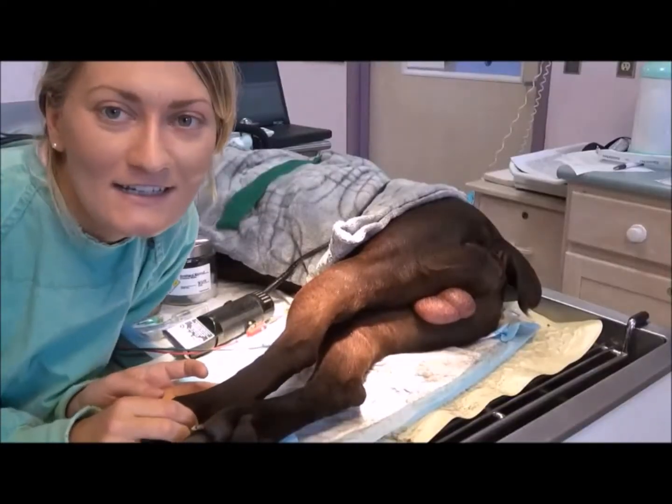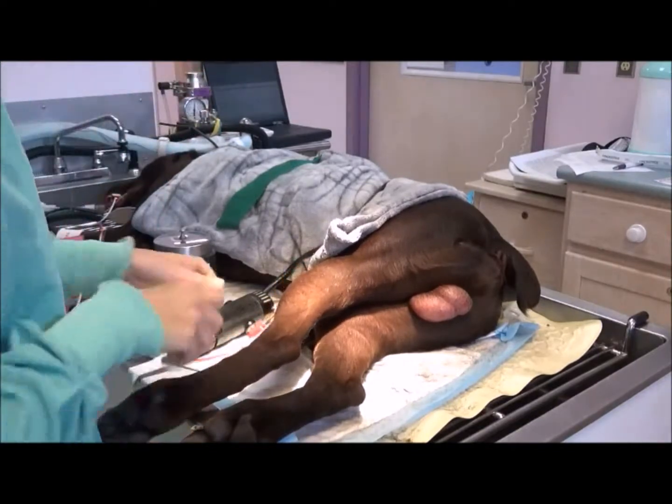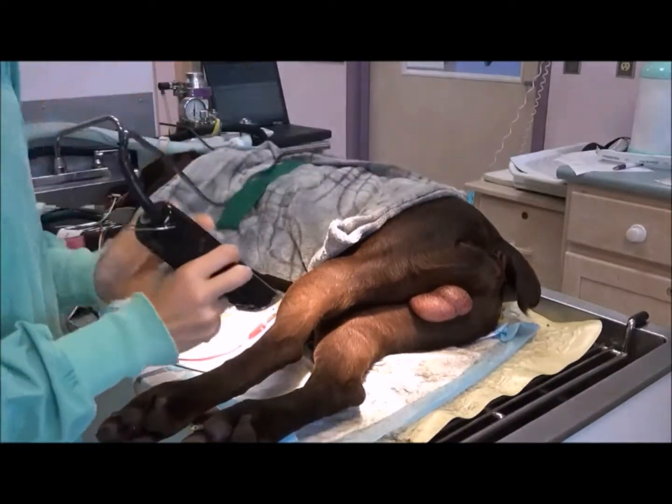I'm now going to place a saphenous catheter into our canine patient. So I'll start by clipping the hair.